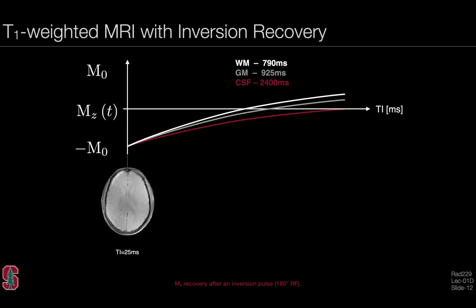So let's look at an example of T1 weighted magnetic resonance imaging using inversion recovery. In this case, we do a thought experiment where all spins for all tissue types would initially be at thermodynamic equilibrium. And if we play an inversion pulse, we can turn the spin system upside down, and they'll now have negative values of the thermodynamic equilibrium magnetization. And that's generally going to be very, very similar values for all tissue types. But now what happens as time evolves is that these tissues will track on different exponential curves depending on their fundamental T1 relaxation time constants.